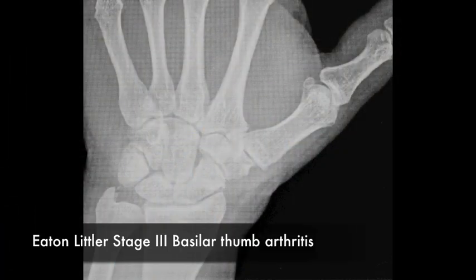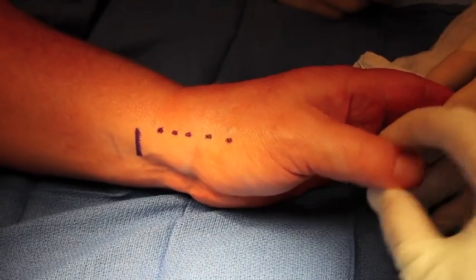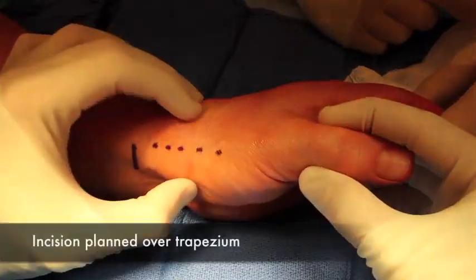You can see at the base of the thumb the sharp trapezium and the arthritis causing the pain. The incision is designed over the base of the thumb and confirmed.